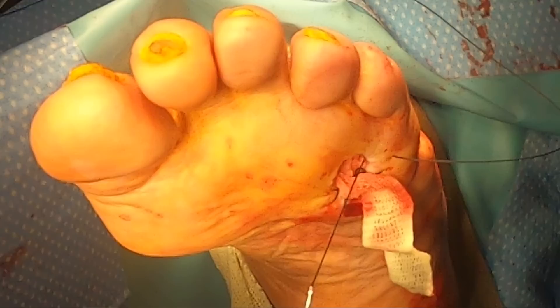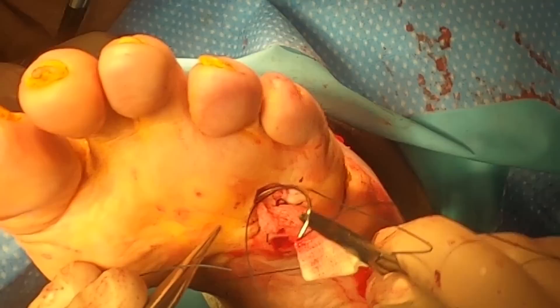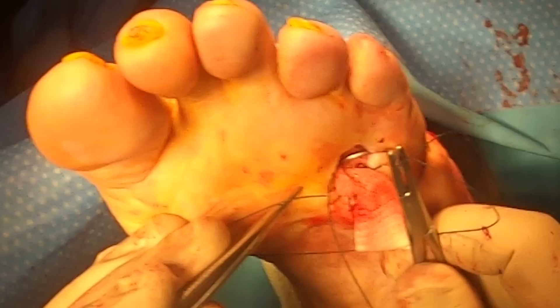This plantar or bottom tissue is really, really tough. This thick needle that we're using definitely does the job. This suture is 2-0 — or it might be 0 — nylon.